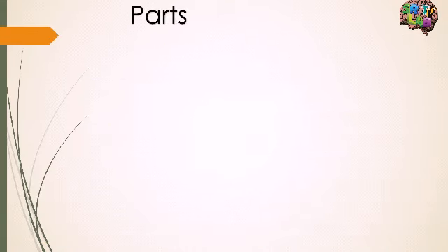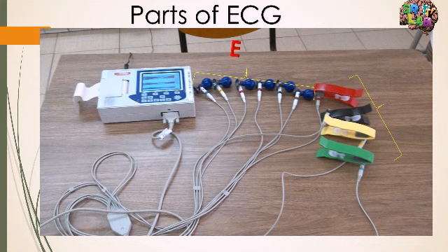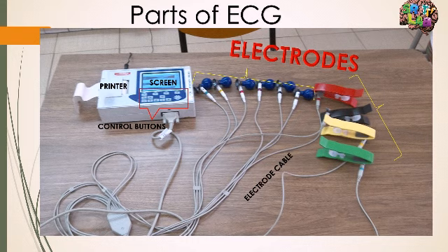Now let's see the parts of the ECG machine. These are the electrodes — the ones placed on the patient's skin. Here is the screen; below the screen are the control buttons, and there is the printer of the ECG. These are the electrode cables.